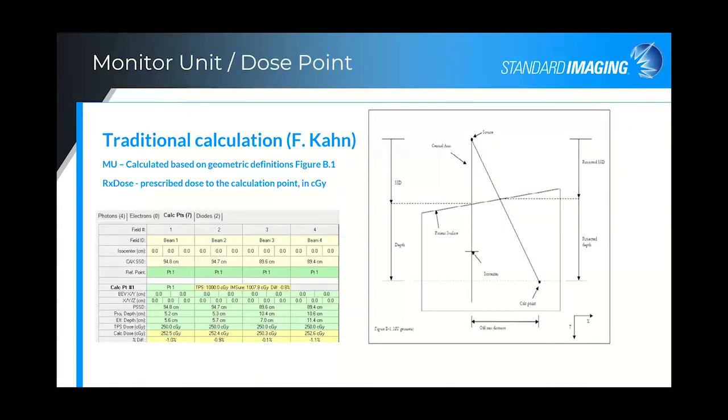So first, the monitor unit module. This one has behind it the traditional calculation from Dr. Kahn. The MU calculation is based primarily on determining the effective depth combined with an effective field size in the plane of the isocenter, along with divergence factors from which the appropriate TMR, head scatter, and phantom scatter factors are determined and used for calculations. And so what I'm showing you here are the different parameters. You can see all of these, the effective depth, as well as a graph of what these parameters mean. And of course, it's important that you understand when you're reviewing in the modules what we're looking at.